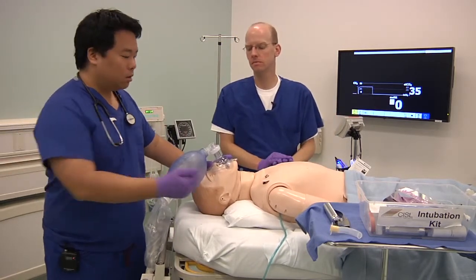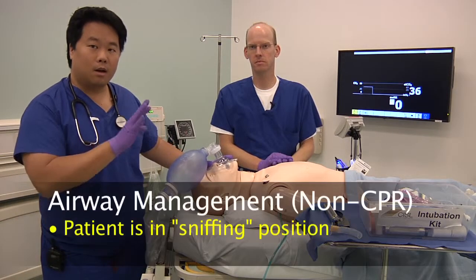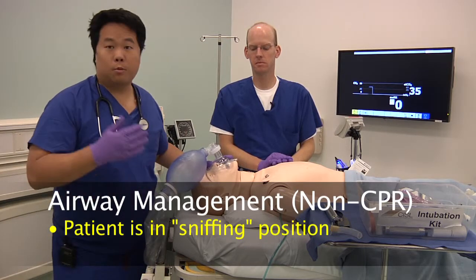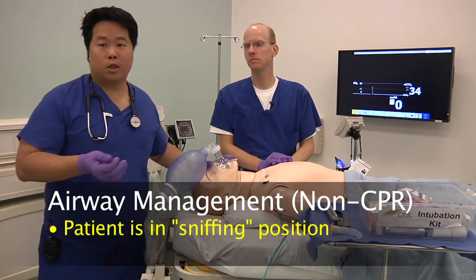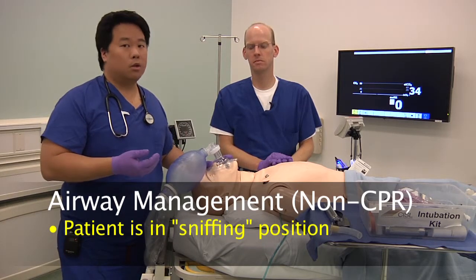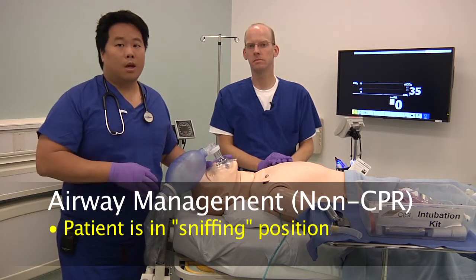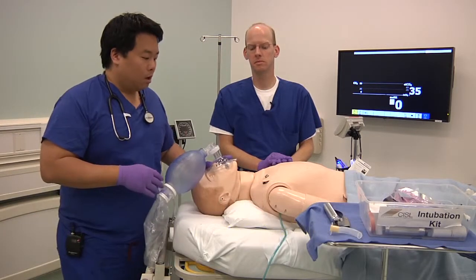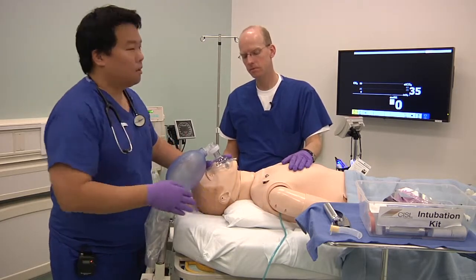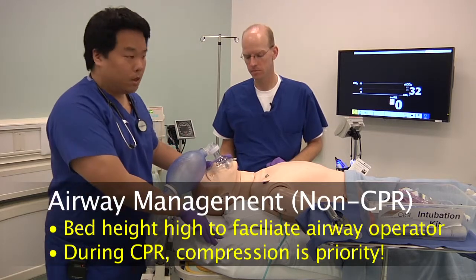The other thing is you'll notice that the patient is positioned much more towards the head of the bed in this non-arrest situation, which you might find in an elective intubation in the ICU, for instance, where the patient is not in arrest, is hemodynamically stable, but requires intubation for some reason. Also, you'll notice that the patient is in a sniffing position, the flexion and extension of the neck to facilitate endotracheal intubation.